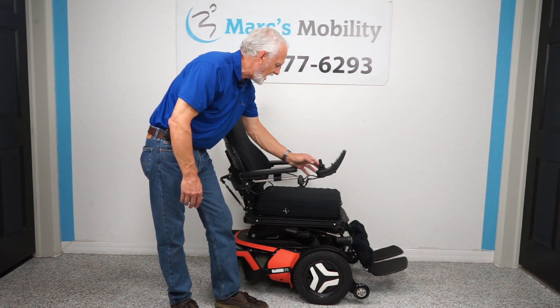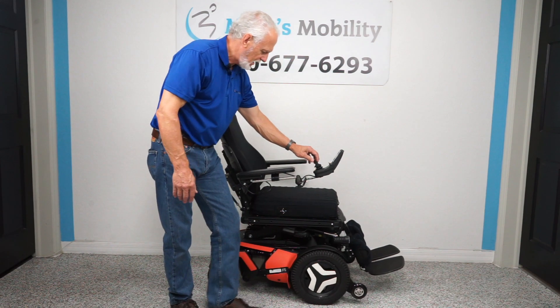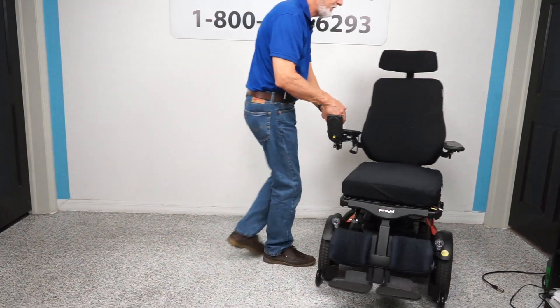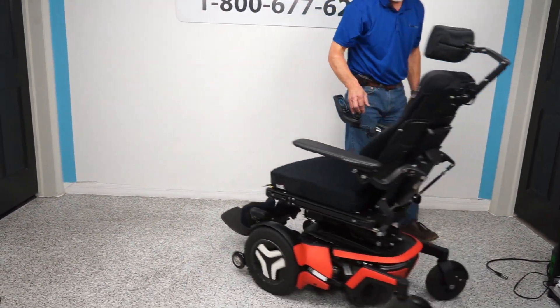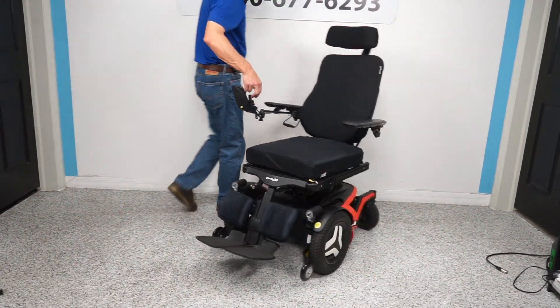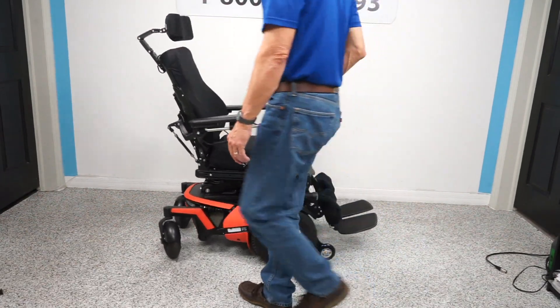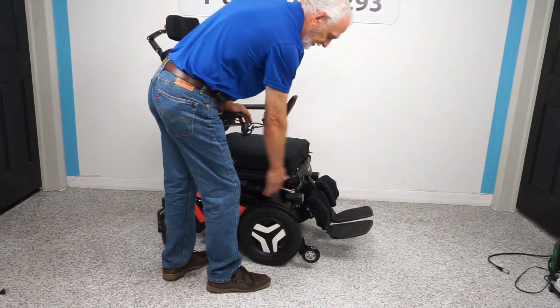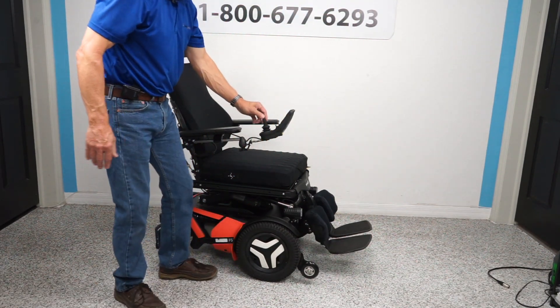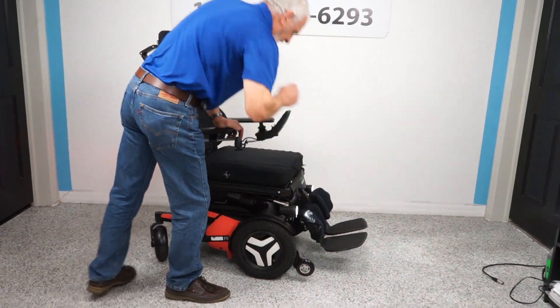We're going to put the chair back in drive and show you how it turns in a circle. That's what you're looking at for turning radius in your house. If you want a tighter circle, bring the legs all the way in — right now the legs are extended out, bring them in and you'll have a better turning radius.